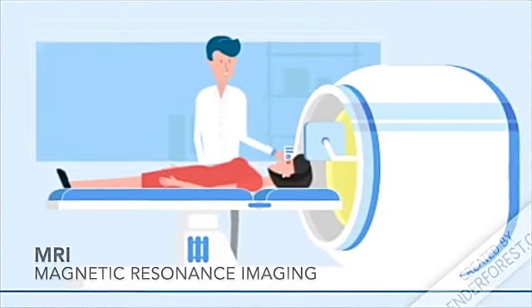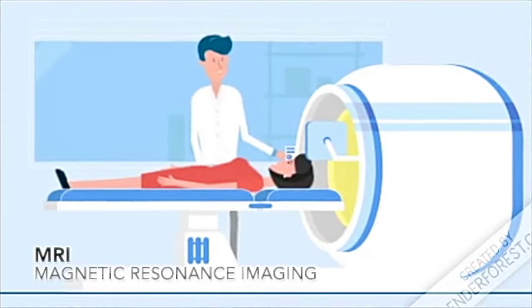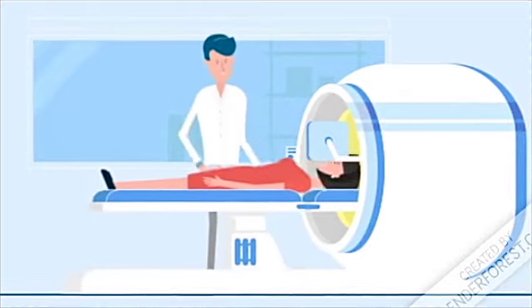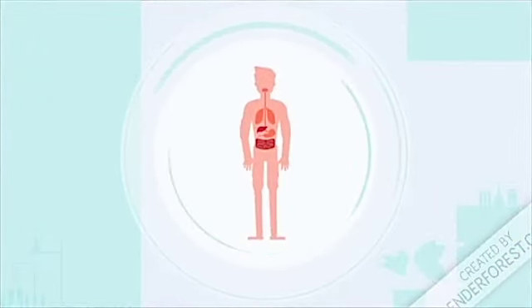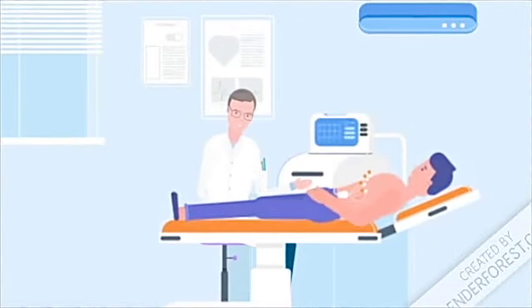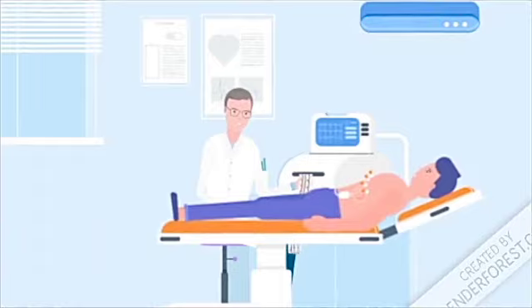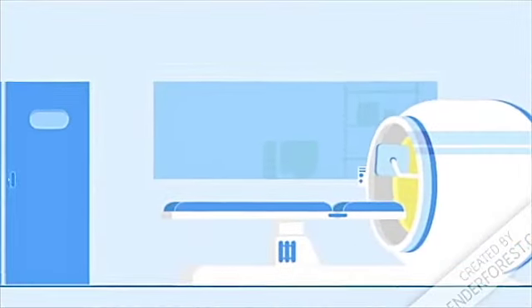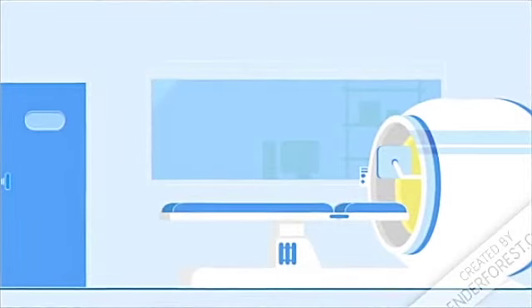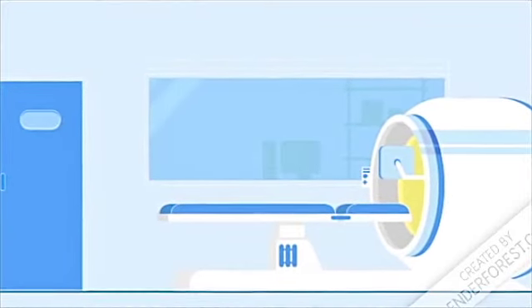Magnetic resonance imaging, or MRI, is a non-invasive imaging technology used in medical investigation. MRIs produce three-dimensional anatomical images of various types of tissues, and these detailed images are used in pathology to detect, diagnose, and treat diseases. The development of MRI has become a stepping stone in the field of diagnostic imaging, especially with the avoidance of exposure to dangerous ionizing radiation.